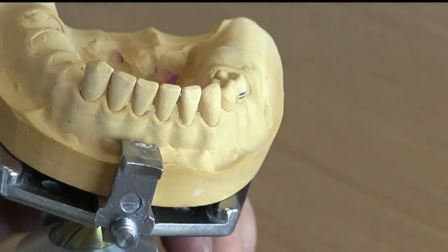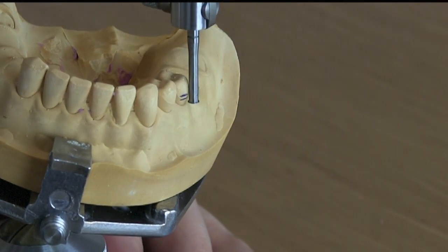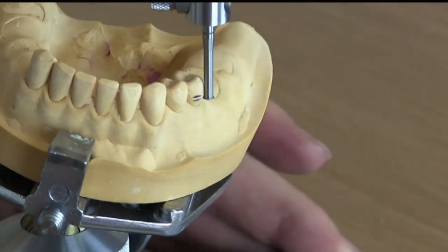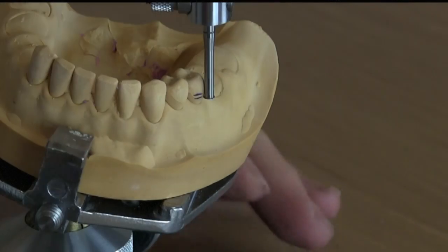So how do we manage this? We could tip the table — we didn't talk about that in the last video but we knew we could. Watch what happens when you tip — I can bring that up and engage exactly where I would like. By tipping the table, I changed the undercut position.